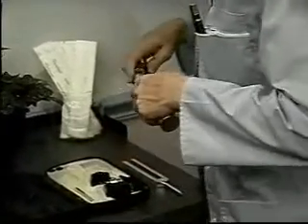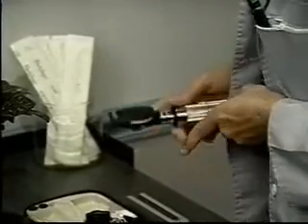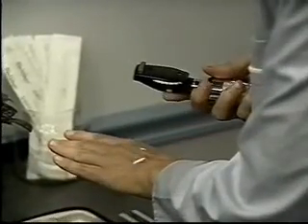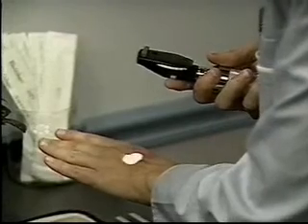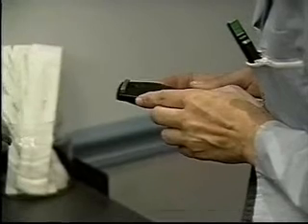When you're ready to examine the fundus, switch on the ophthalmoscope light and adjust it to the large round beam of white light. Also, make sure the light is bright enough. Set the ophthalmoscope to 0 diopters.